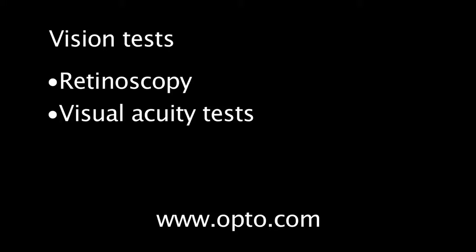Your vision and prescription will be assessed using a couple of techniques. The first is an objective measure that is done without getting feedback from the patient. This can be done using either an autorefractor or a retinoscope or both. This is an invaluable technique for assessing the vision of children and those who may not be able to communicate.